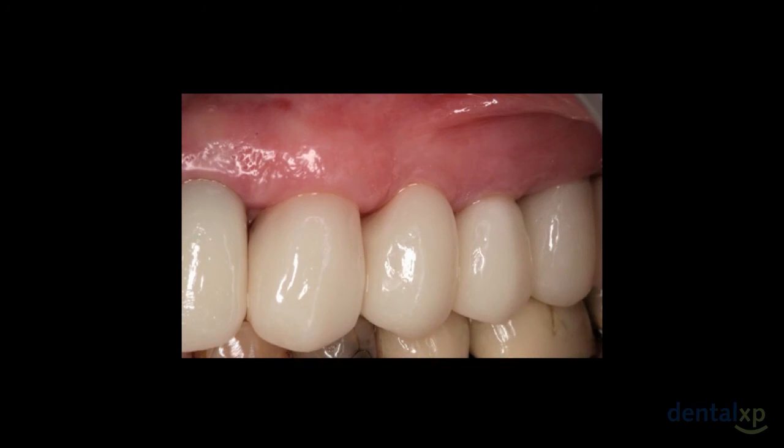The final restoration, and you'll notice that the tissue has no clue that the restorations are in place. These are all feldspathic porcelain restorations with supragingival margins prepped to 0.3 of a millimeter. In the real world, it's hard to get a lab to really do feldspathic porcelain unless you have your own lab.